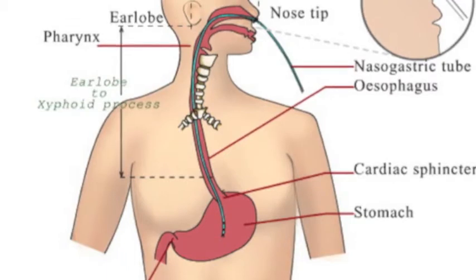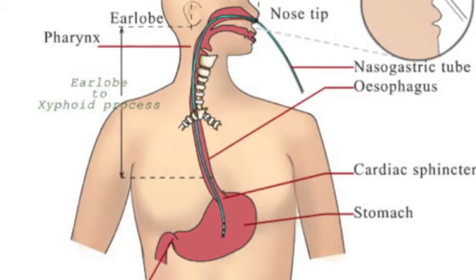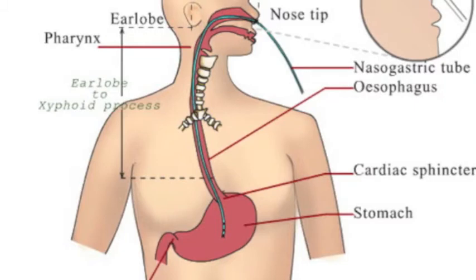Okay. And so, to clarify, the rationale for suctioning stuff out is if they're just so full. If you're decompressing, you have to get those gastric contents out, right? So you have to relieve the stomach from working. So you just pull it off. If they have a GI bleed, all that stuff goes out. So whatever's in there, fluid, blood, stool, whatever's in there, it'll all come out.